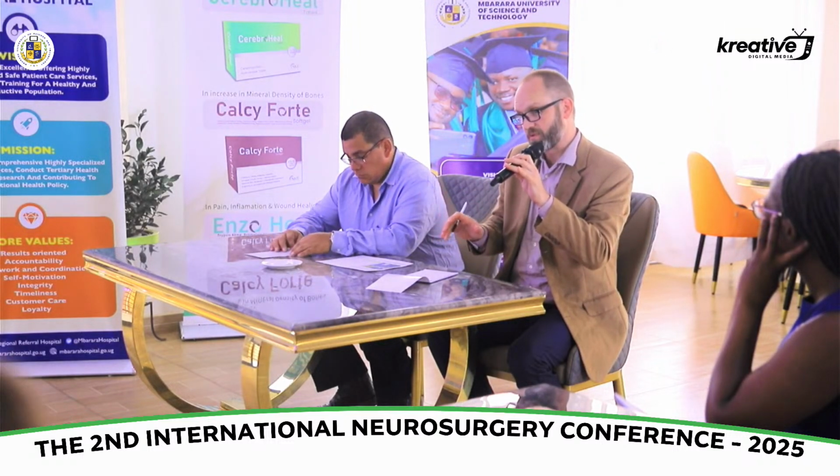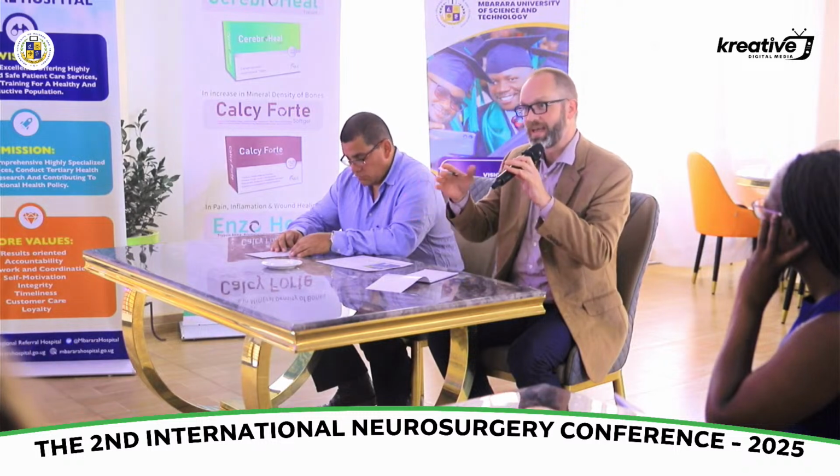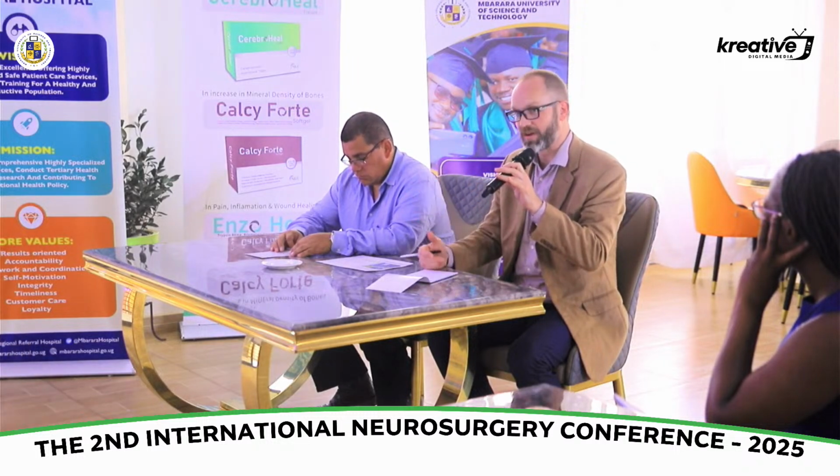And more important is learn B mode, be comfortable with B mode for basic things, then get into vascular imaging. And then the vascular imaging can be very useful also at the bedside in the ICU or the HDU to help follow these patients.